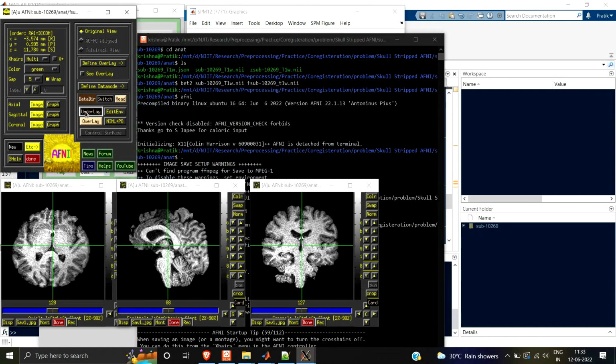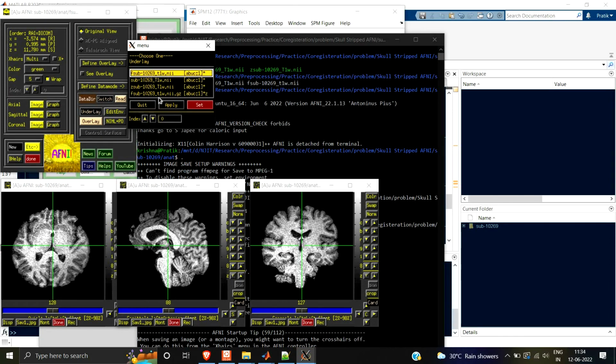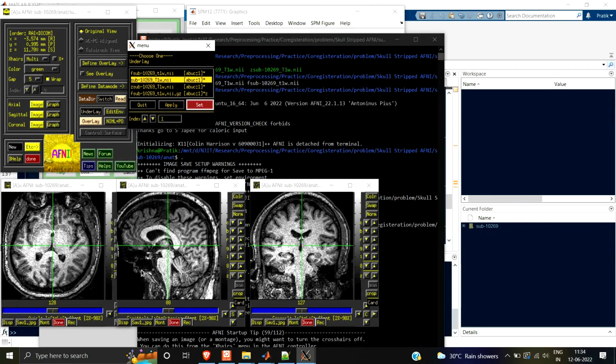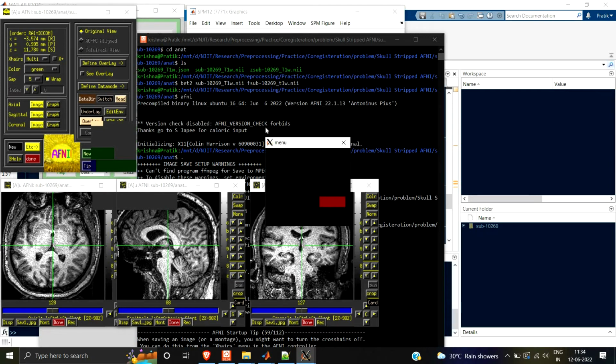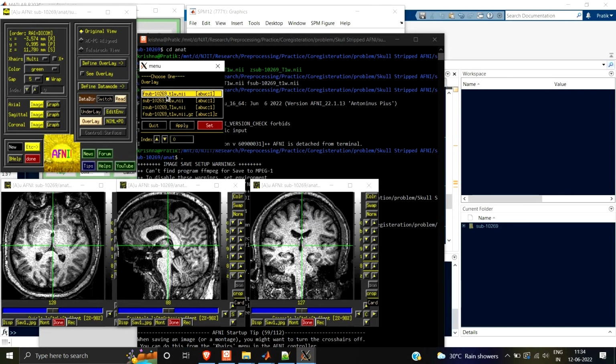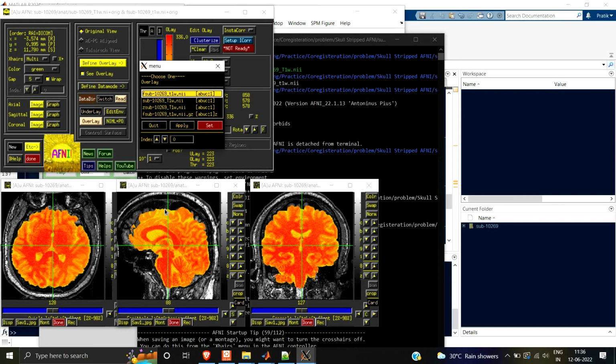Okay, so let me underlay the original anatomical image. This is the original anatomical image. Now I will overlay the FSL brain extraction image. So you can see this is how FSL has extracted the brain.